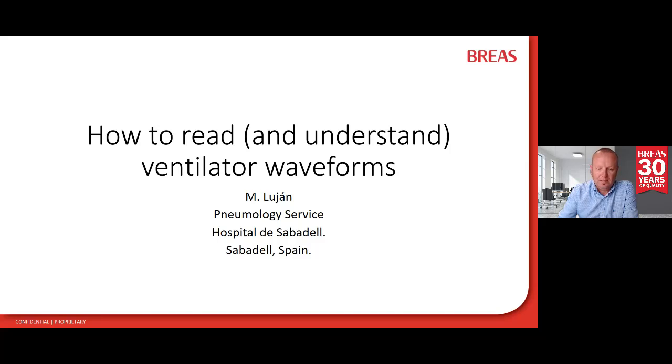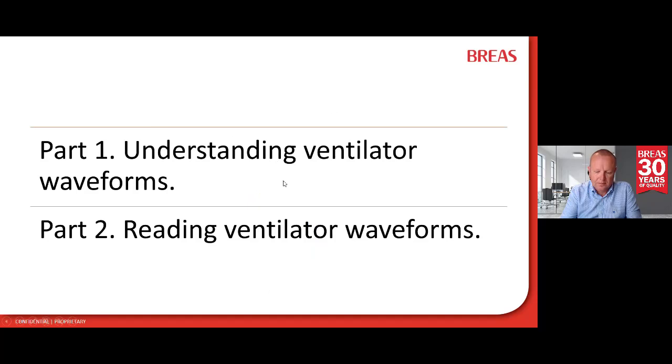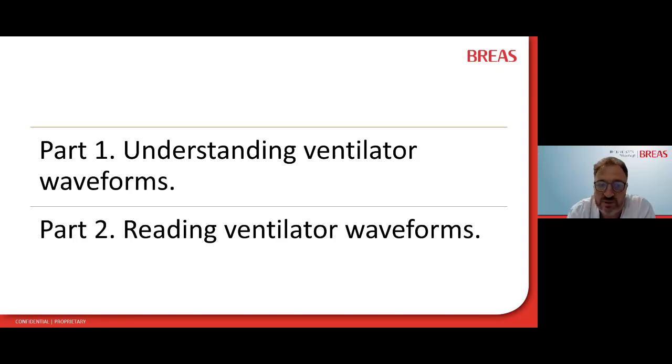In my opinion, it is not only important to know how to read ventilator waveforms. It is also important to understand ventilator waveforms. For that reason, I've included a first part talking about how we can understand ventilator waveforms, and a second part dedicated to the systematic reading of ventilator waveforms.